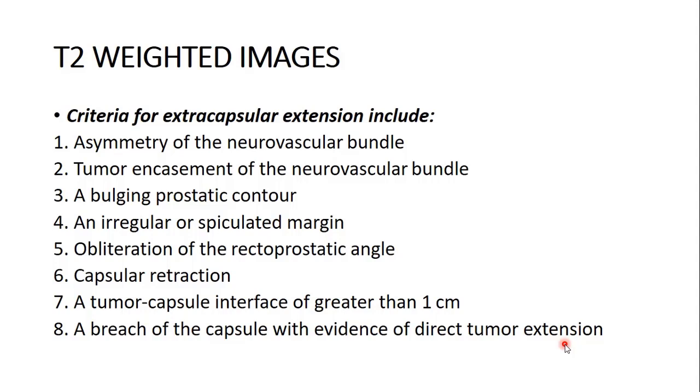So we can say that to label the disease at T3 or T4 we need imaging, and we cannot say that they can be diagnosed clinically, as is labeled in the books and guidelines, that all the T staging is based upon DRE findings and imaging has no role in it. T3 and further is basically diagnosed on imaging. You cannot detect it clinically.